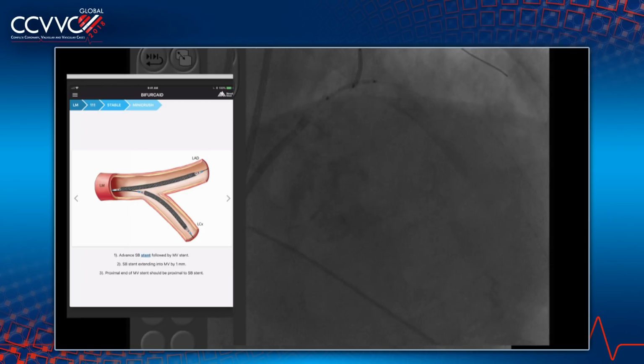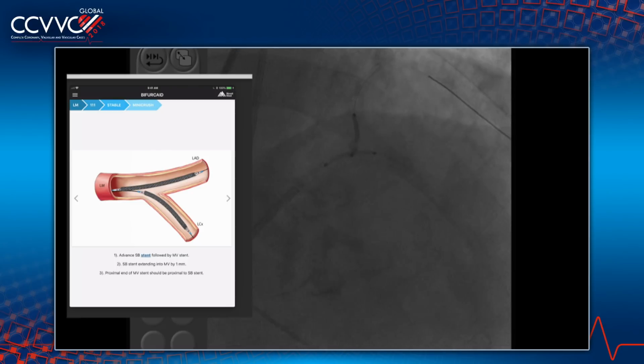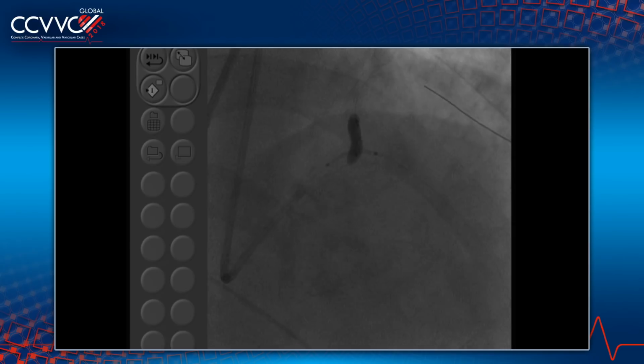So as I am saying that, you can see live here what is being done. Let's see what's going on live, because that's more exciting. No, just leave the app aside, but tell us what's going on with the live, Dr. Sharma. They won't know what to do. You got to keep going. Why do you have to go to the phone? You're supposed to know these things. That's what you think, Dr. People are learning. I think you're under the impression that everyone knows everything the way you know it.